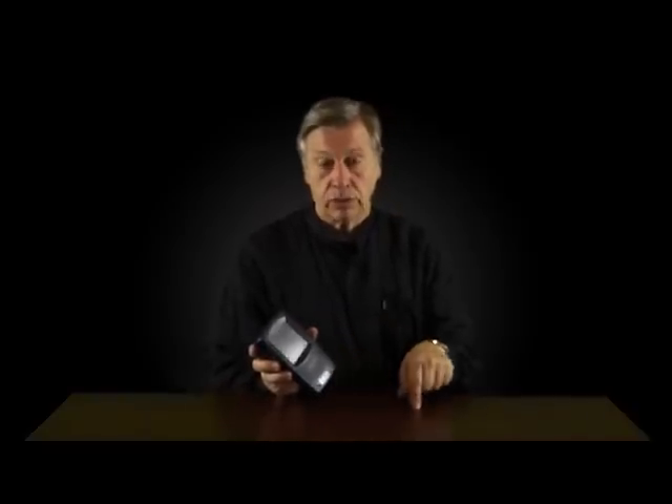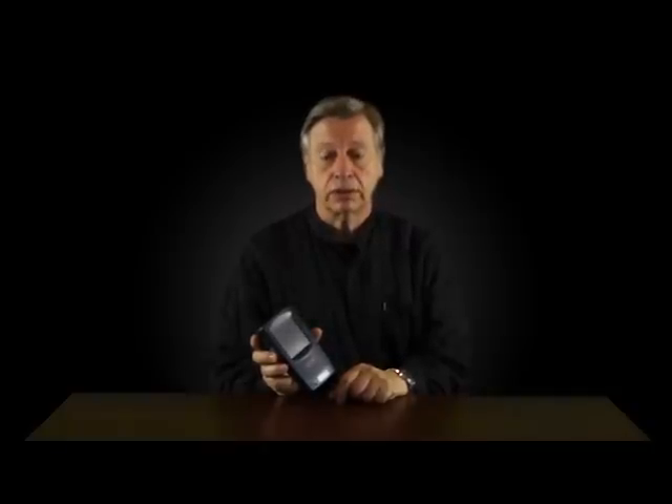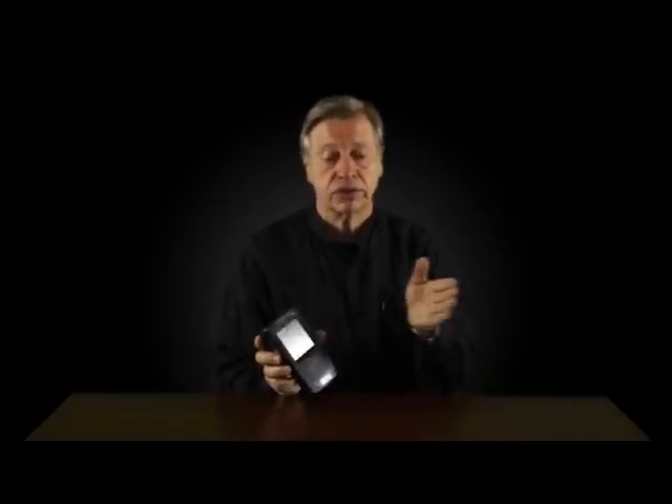When you're back in the office, this plugs into the computer via a USB cable and you can use the powerful Biograph Infinity software with the Rehabilitation Suite. This software allows you to save data points every second or every tenth of a second. It also allows you to set thresholds, save the data, review the data, do reports, and compare sessions between this client and other clients. It's extremely versatile and extremely powerful.